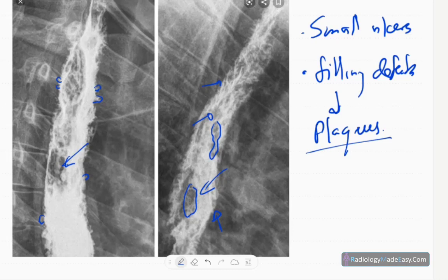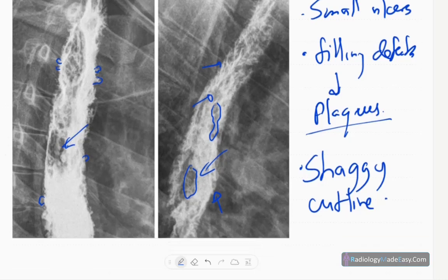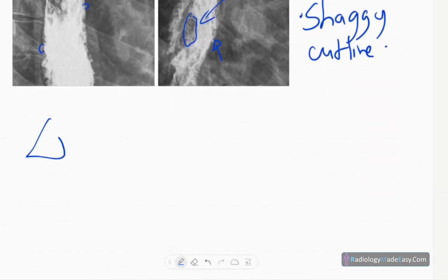Due to these small ulcers and plaques, it has a shaggy outline. There are no obvious obstructions — smooth passage of contrast is seen. No dilatations in the esophagus, no leakage of contrast to the outside, and no abnormal fistula tracks visualized. Bones are also normal.